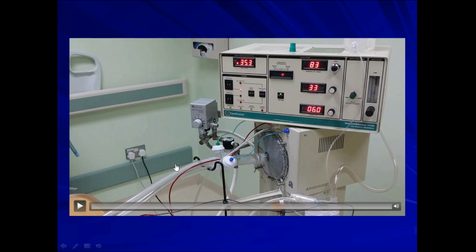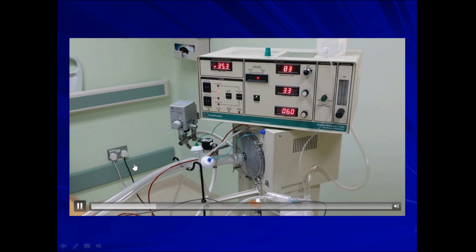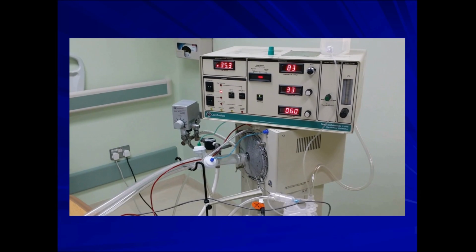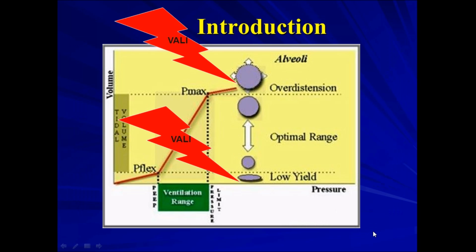Just to let you know, for those who don't know what I'm talking about, this is the machine we are talking about, the high frequency oscillator. It is different from the usual mechanical ventilation, the conventional machines. It has different settings and a different theory. We are trying to cover this machine in this presentation.